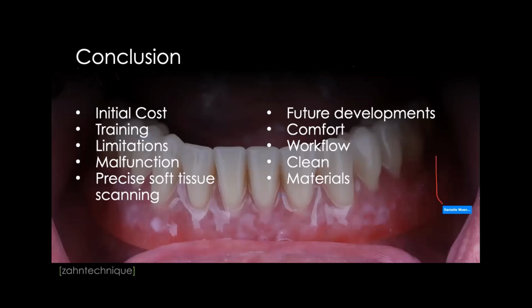What I see a lot is also the comfort, right? It's so much more comfortable to get a scan done than that gooky impression, right? That's a really good thing. Workflows are amazing. I've lectured on this specific thing for over 10 years now. The workflow in digital dentistry, what I love the most is the team approach, because we now can really work in a team like this.